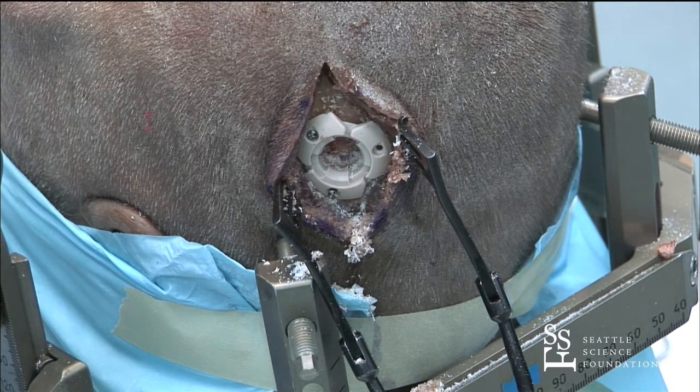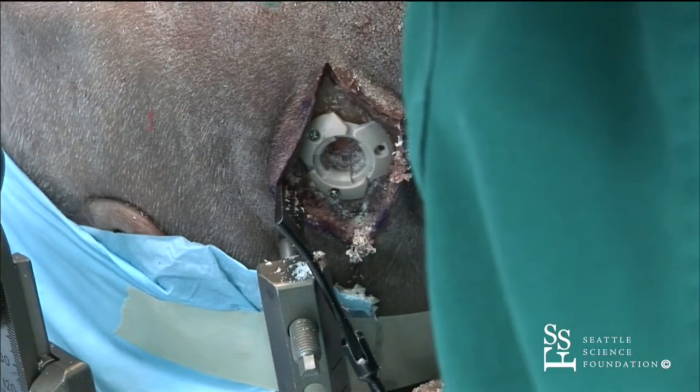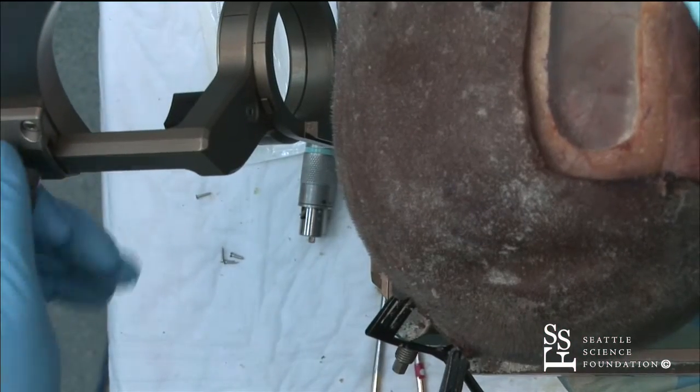And then, as usual, you want to not forget to take this off and put it on your microdrive. So we'll swing this down.